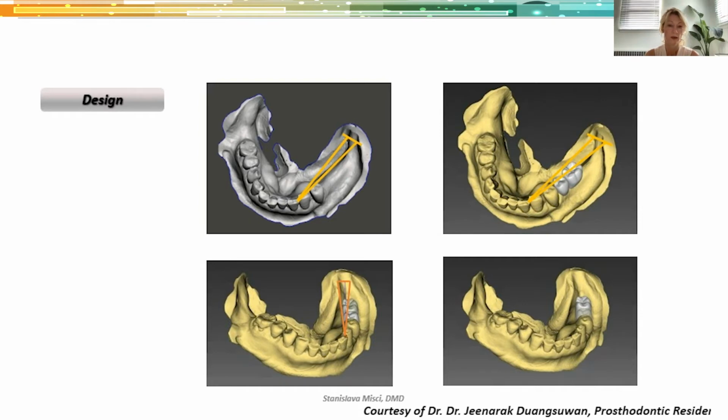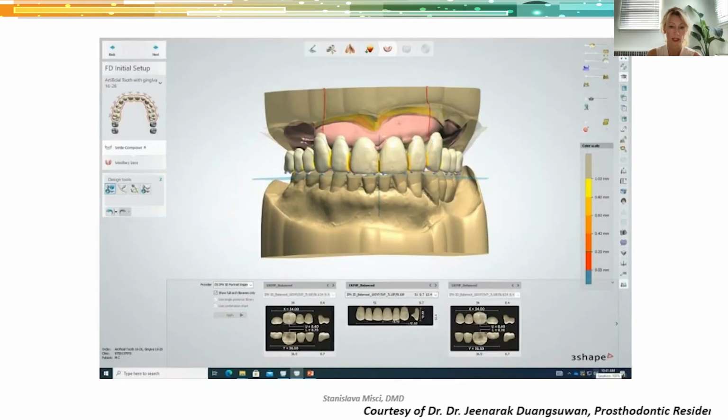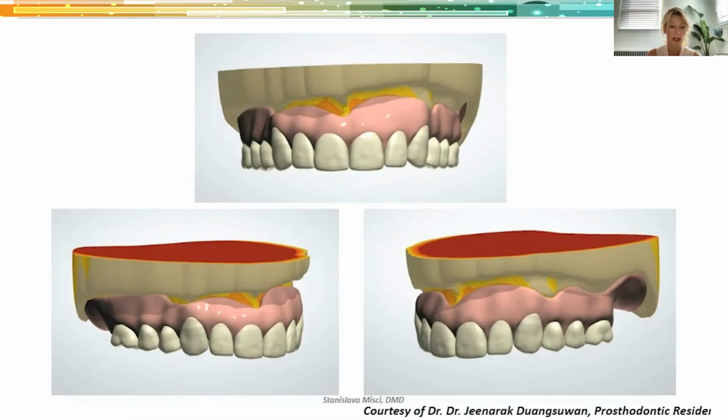So based on that, now we can develop our maxillary plane of occlusion. We already had the incisal edge position for the maxillary teeth. As I said, we knew how much we wanted to build the mandibular incisal edge. We had the vertical dimension, we had CR, and we developed the posterior plane of occlusion based on Pound's triangle. And now we can digitally design and fabricate the immediate denture for this case. So this is all part of the planning. The tooth setup, and these are the dentures.